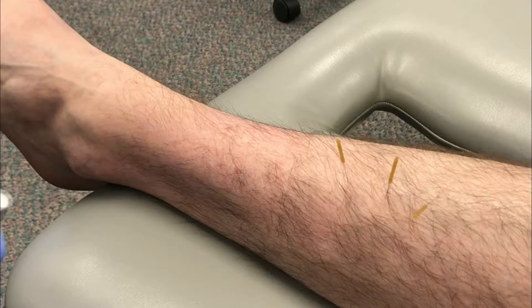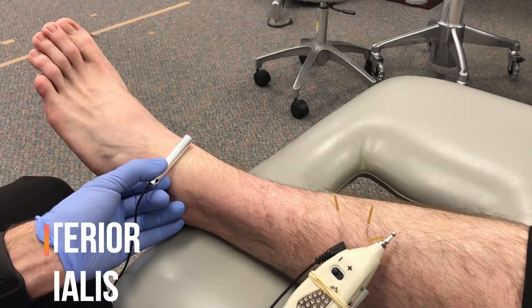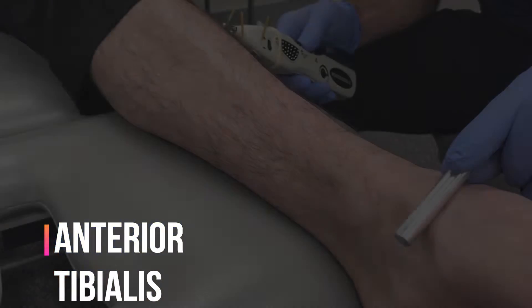So what I've done here is placed a needle in the location I think each of those muscles lies — one in the anterior tib, one in the extensor digitorum longus, and one in the extensor hallucis longus. Now I can use any e-stim device to put a current through the muscle to get it to contract and verify that I'm actually in the muscle.